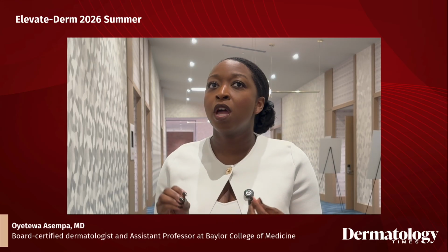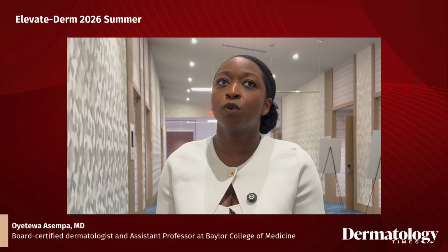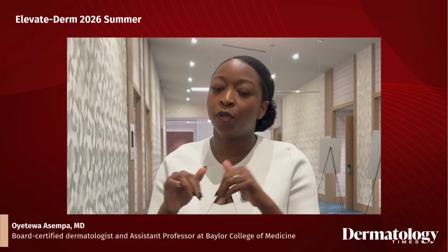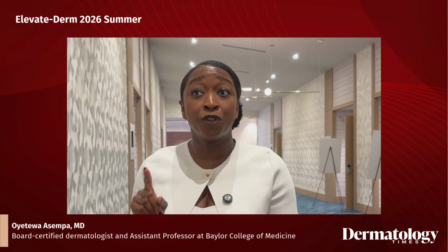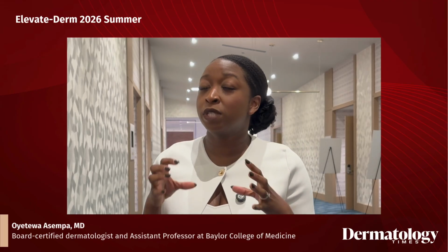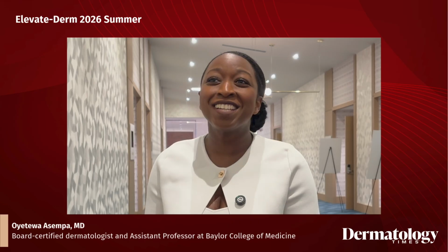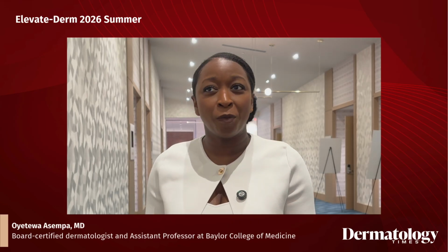I think for the hair loss talks, really the biggest things are understanding how to diagnose hair loss in patients with hair loss. So really getting in there, touching the scalp. A lot of times patients will come to me and say, the last person didn't even touch me, right? So touching the scalp, looking throughout the entire scalp, and then using your dermatoscope for trichoscopy, those magnified images of the scalp. You cannot diagnose hair loss without it. So, if you're trying to diagnose hair loss and you're not using a dermatoscope, then really you're probably getting it wrong. So I think that's my biggest pearl for the hair loss.